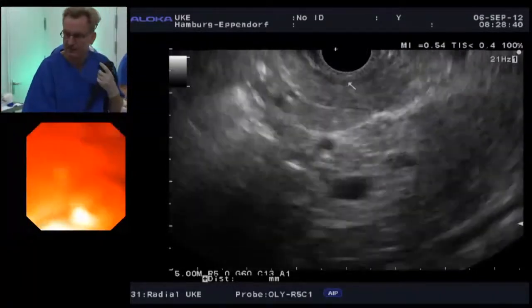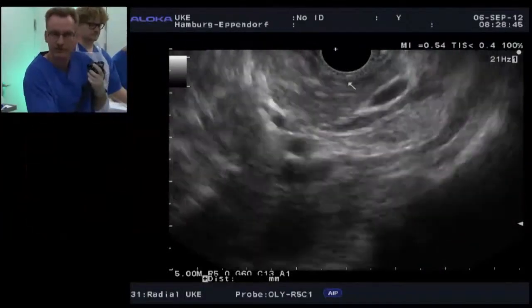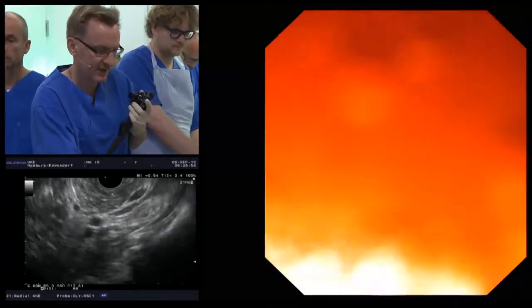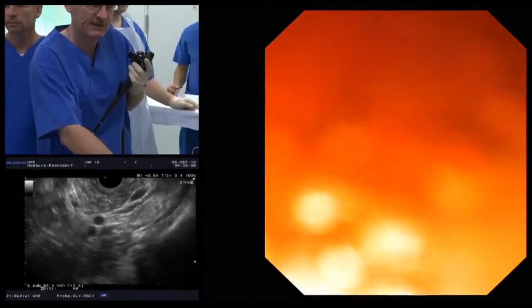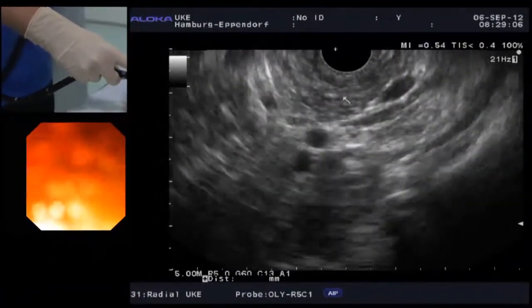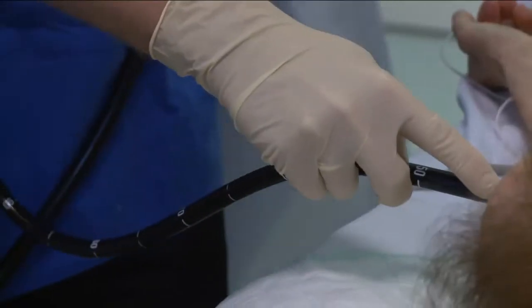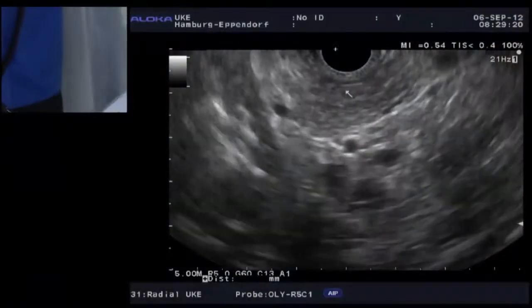If I start the pancreatic examination, I start, if the cameraman can show the endoscope here please. Can you switch to the endoscope please? I start at, I say, 45 centimeters plus minus, and she's a little old lady, and she is only 150 centimeters, so it's 42 centimeters. Then the endoscope. Here you see my finger, please. My finger is at 45 centimeters, but in the image it is at 45 centimeters. Here, 45 centimeters.